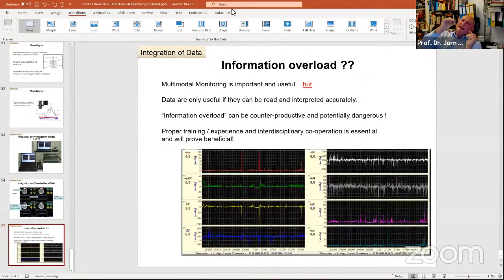And you always have to take into consideration where your probe is, but also the special patient. What we try to do, as I said, if you have a general brain concussion or contusion, for instance brain swelling, you put the PO2 probe in the frontal lobe. That's the easiest. That's a relatively good correlation.